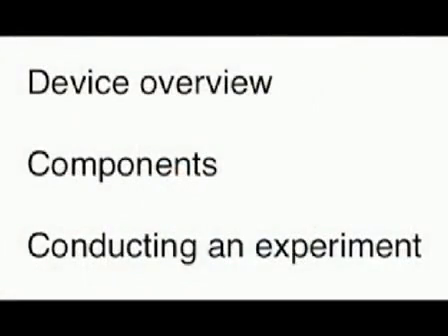TAPS is a device for measuring passive tactile spatial acuity on the fingertip, and I developed it at Duquesne University in Pittsburgh, Pennsylvania with Ingrid Canix, and we've since modified it at McMaster University here in Hamilton, Ontario, with Ryan and Mike. This device is a method for delivering controlled tactile stimuli to the fingertip, controlling for force, onset velocity, and stimulus duration. This video is organized into 3 sections.